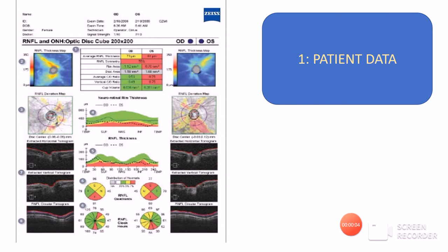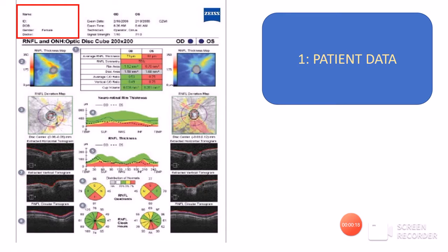Let us start by reading a printout of an OCT which is showing the RNFL and the ONH analysis. The first point that we see is the patient data. The patient information consists of the name, age, sex, examination date and time, date of birth, and registration number. All this is very important and needs to be fed correctly into the machine, because it can be used later for correlation with further printouts to find out whether the glaucomatous defect is progressing or not.